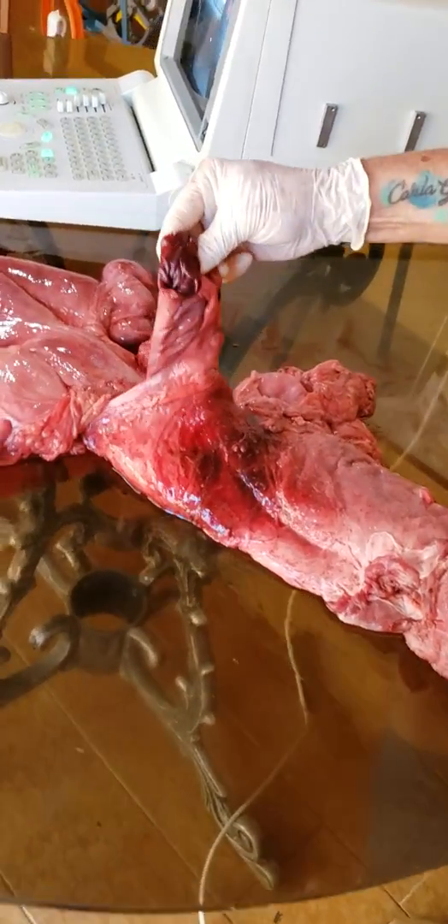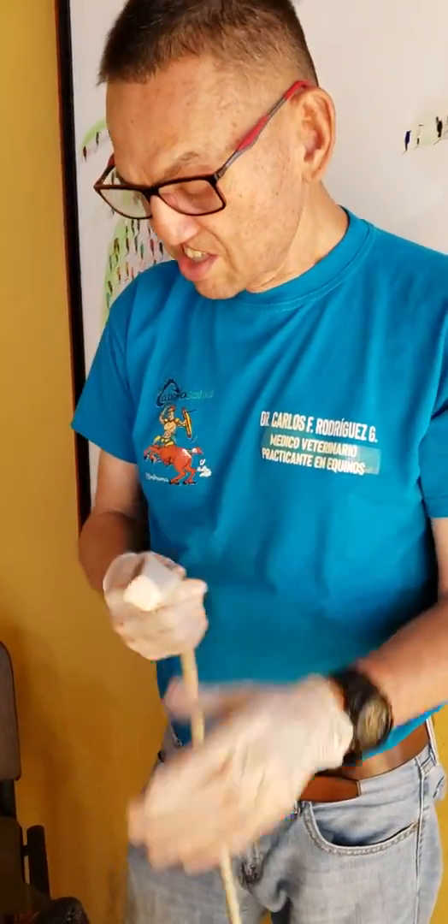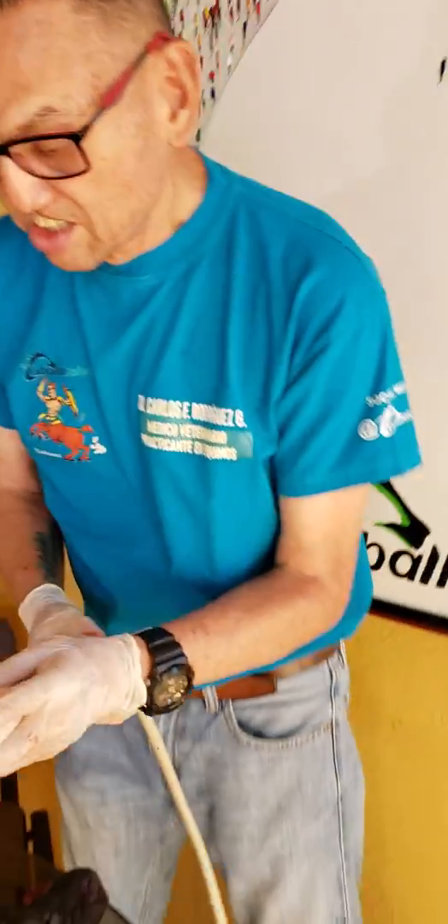One of the first mistakes that students make is they kill the horse when they are examining it, because they cause rupture of the rectal mucosa. So this is the first mistake — the first challenge is not to kill the horse when you are checking it via transrectal examination.